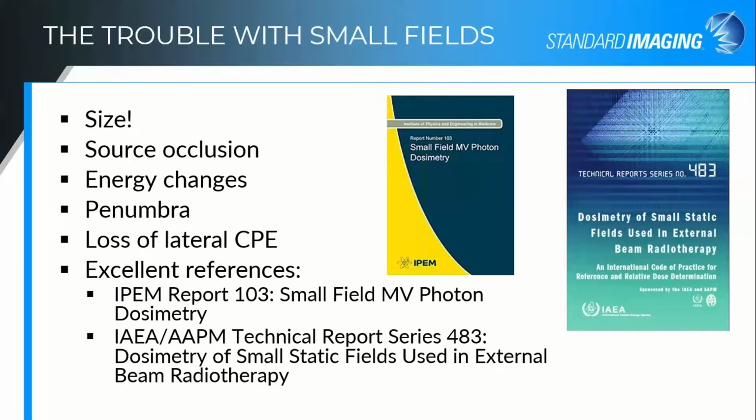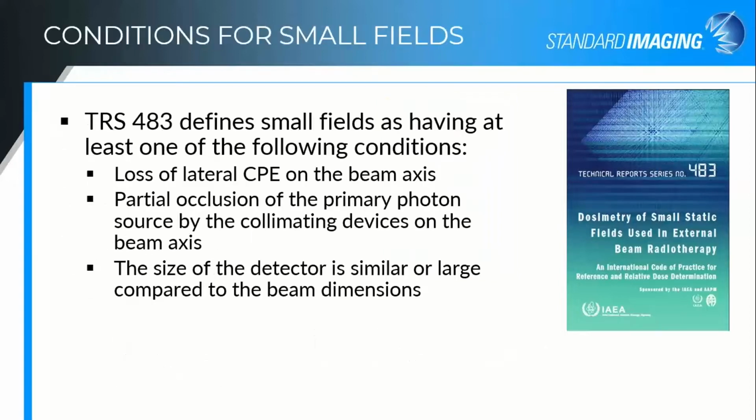Most of what I'm talking about in terms of the physics, or the concepts that we need to think about, come from a couple of publications. One is IPEM Report number 103, Small Field Megavoltage Photon Dosimetry. And the other is the joint publication from the AAPM and the IAEA on dosimetry of small static fields used in external beam radiotherapy. So that's TRS 483.